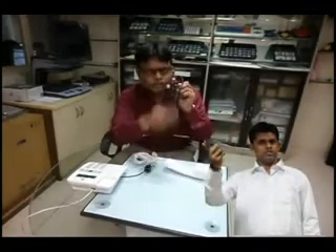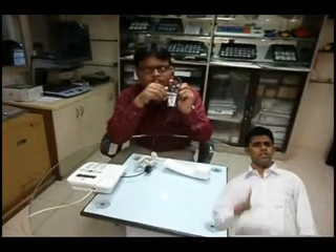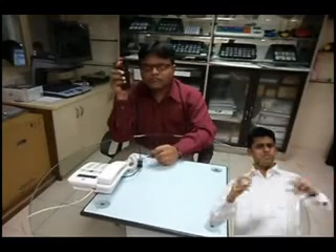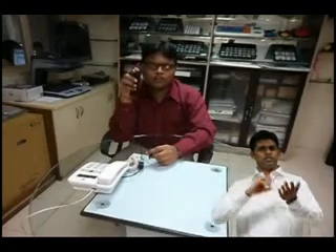You can use the Listener Pro to adjust the volume and the tone settings while you are speaking, such that you can listen to the person clearly. In this way, using the Listener Pro and the Telephone Kit, you can easily access your landline phones whether in office or at home.